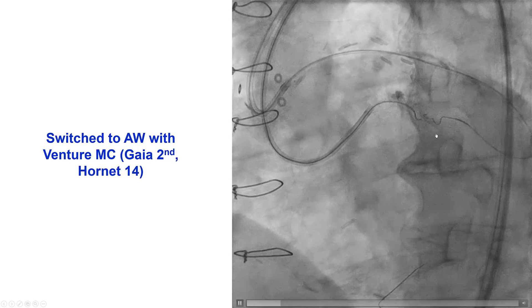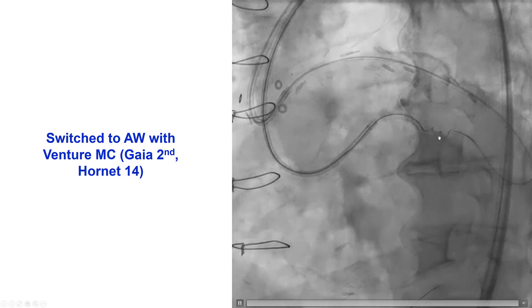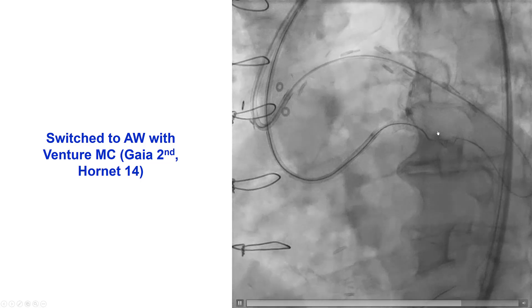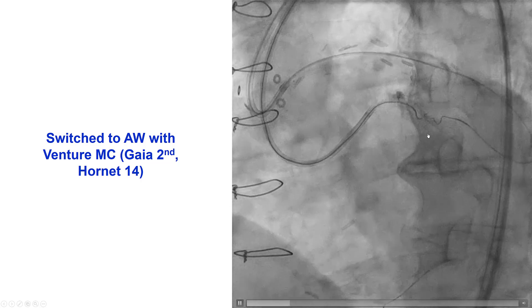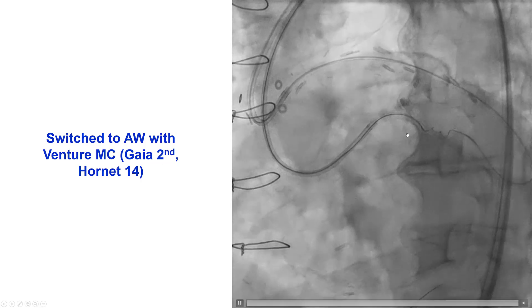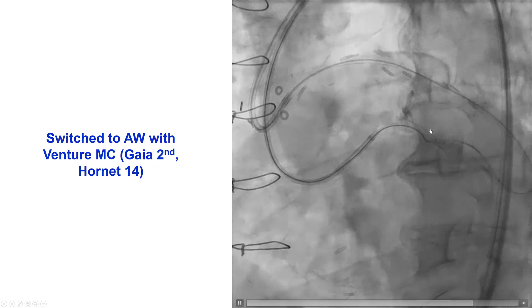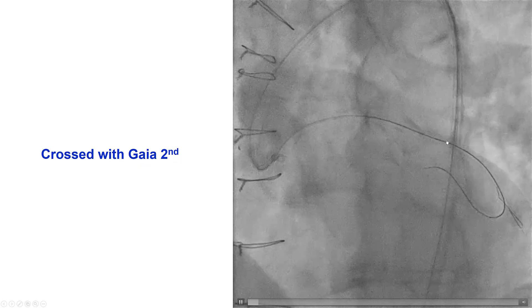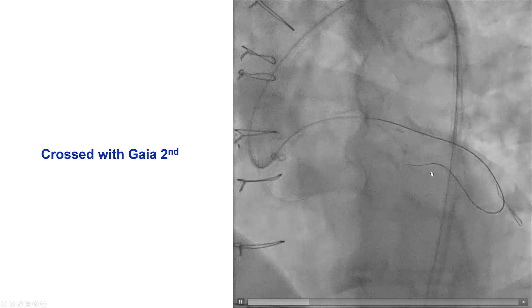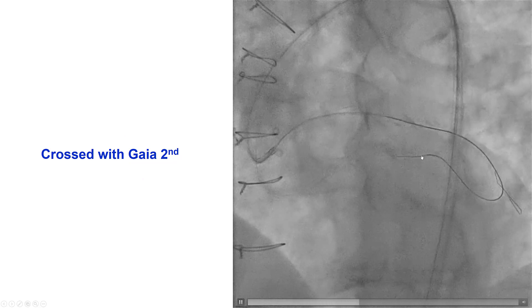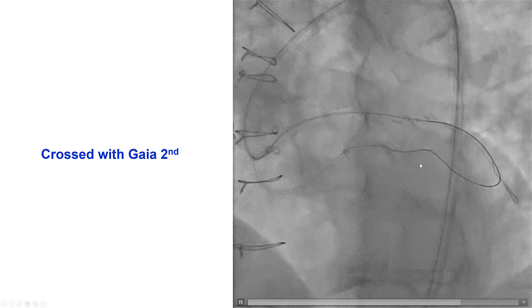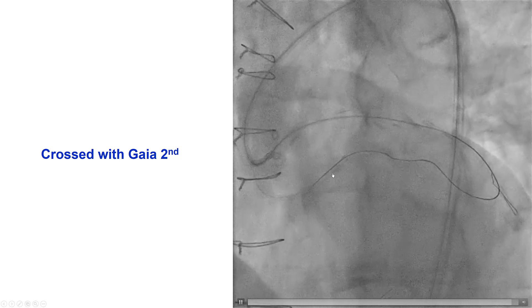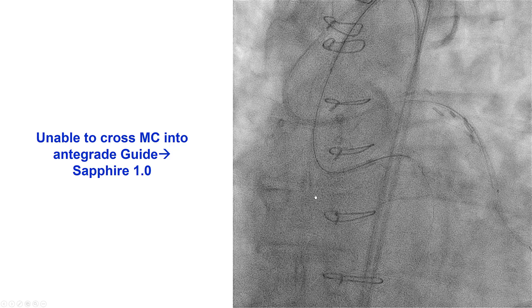We then tried again after advancing the microcatheter further, to cross into the proximal true lumen using a PILOT200 and a Gaia Second, but unfortunately the wire seemed to just wrap around in the extraplaque space. We decided to do a brief antegrade attempt using the retrograde guide wire as a marker of where the ostium of the vessel was. We used a Venture angulated microcatheter along with a Gaia Second and a Hornet 14, but unfortunately we could not advance a guide wire antegrade.